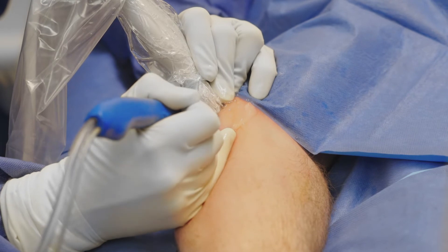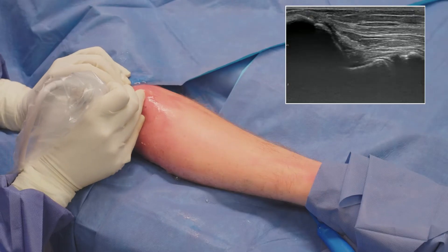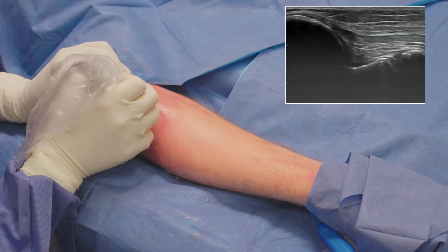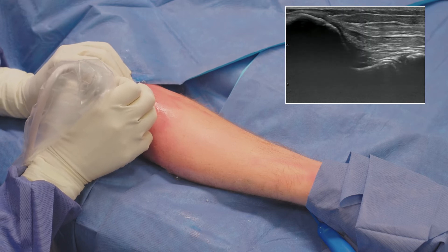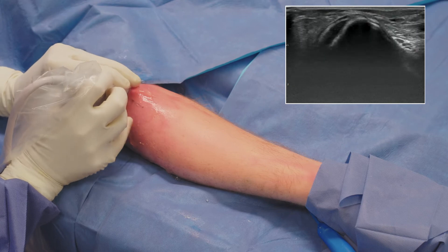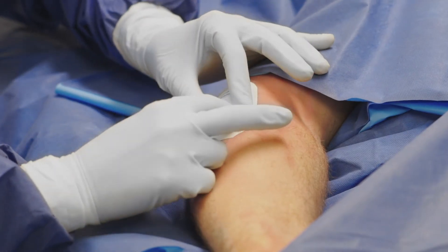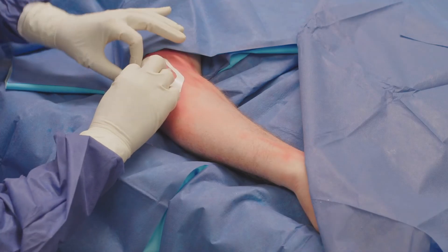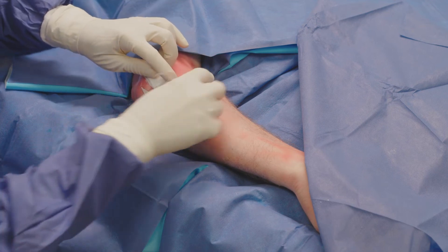Depending on what I see on ultrasound, I repeatedly reposition the probe, scan the tendon to identify and debride any remaining diseased tissue, and this usually takes three to five minutes to debride all of the diseased areas. I can see that we have great consistency now throughout the tendon. Since the procedure is performed through a stab incision, there is no need for sutures. I place a steristrip and a small gauze band-aid over the incision, which is then covered with tegaderm.